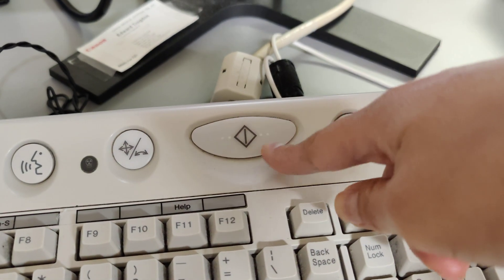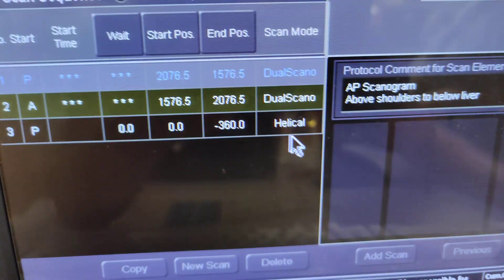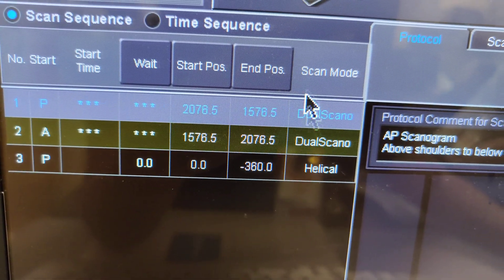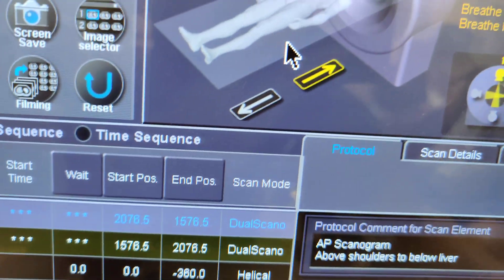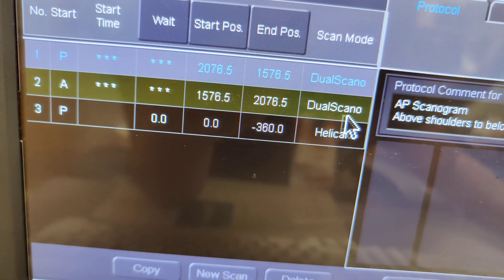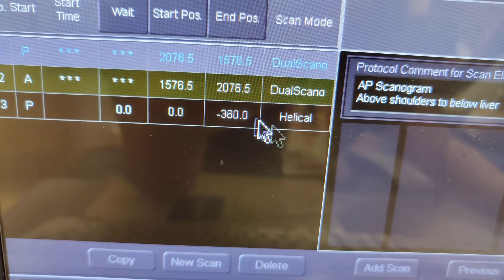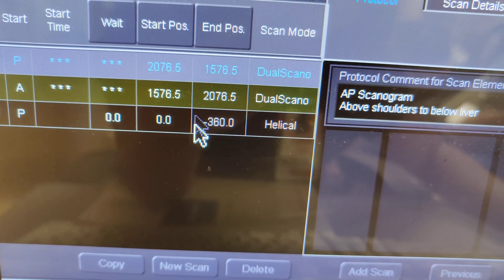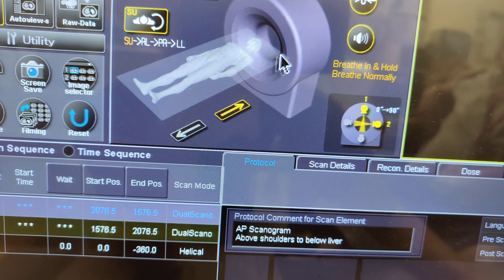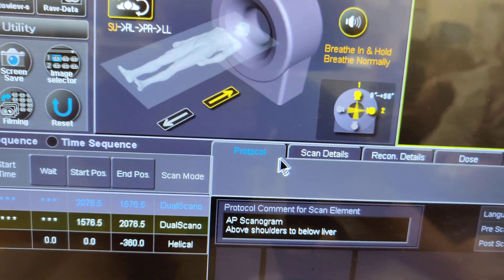Your next scan type is the helical. It'll pause so you can set up with your scout, and then it's a helical scan — meaning a spiral scan. It'll just continuously and slowly move in with a pitch, spiraling through the anatomy.